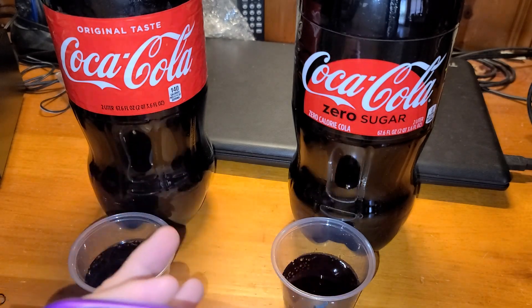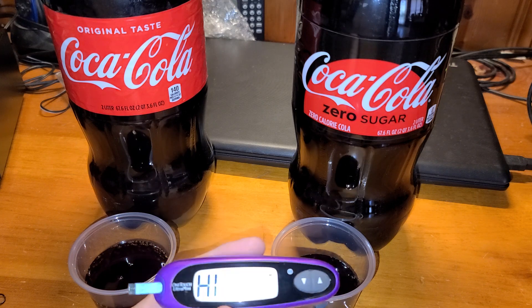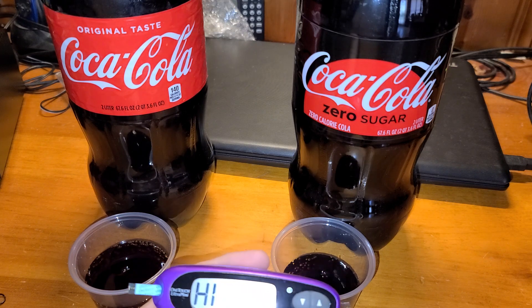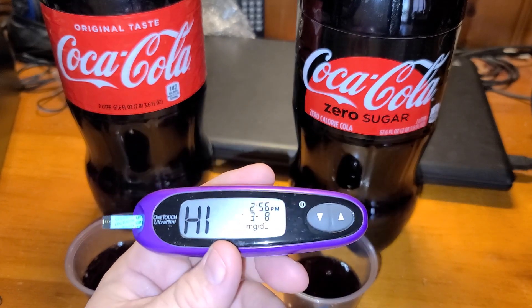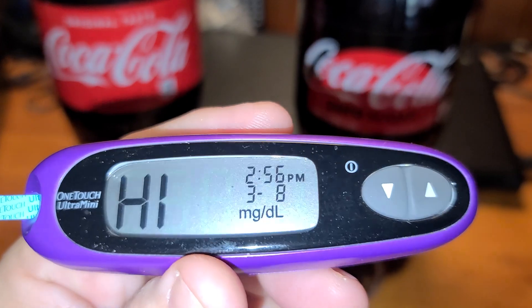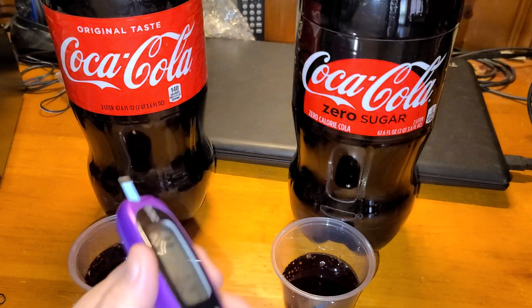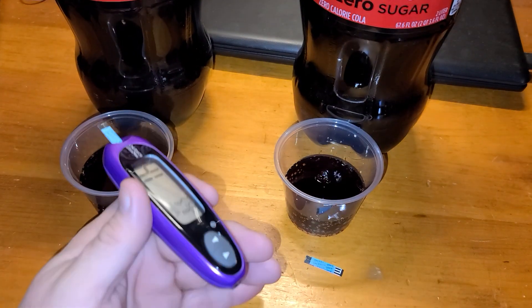They taste extremely different, as far as I care. I don't ingest sugar — I'm a diabetic, I keep it low. The last time I checked, it was like 79 or whatever. The dates are all screwed up on these things. But there you go — see that? High. And the Coke Zero showed low.